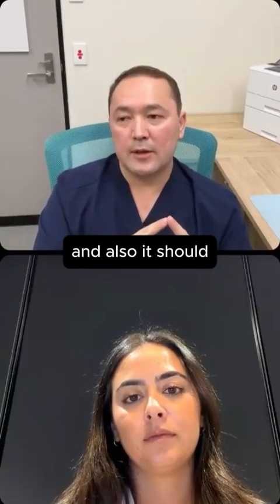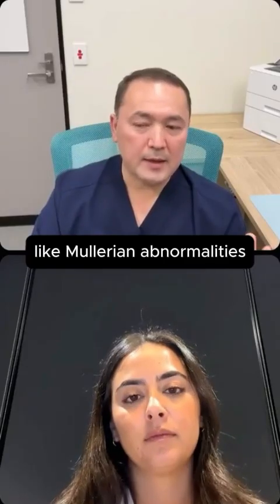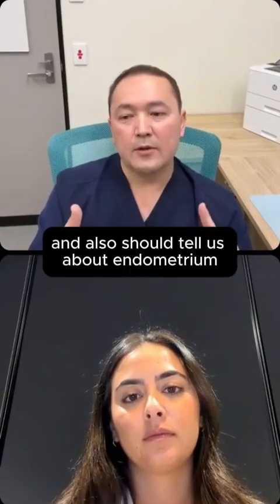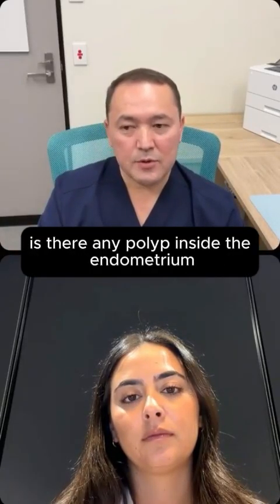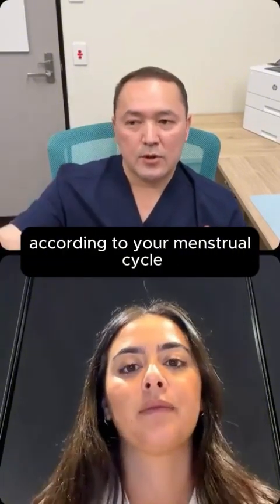And also it should tell us whether there's any abnormality in the uterus, like Mullerian abnormalities such as arcuate uterus, bicornuate uterus, or septate uterus. And also it should tell us about the endometrium. Is there any polyp inside the endometrium? And also the endometrial thickness according to your menstrual cycle.